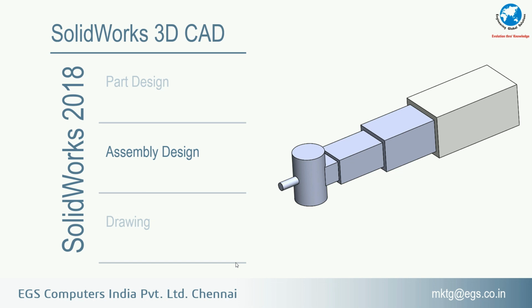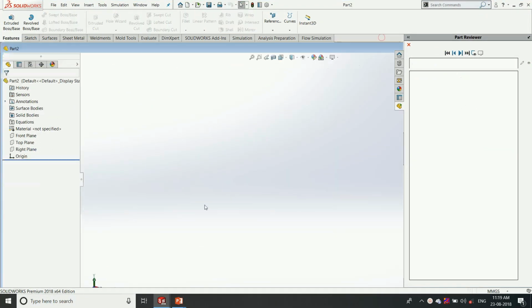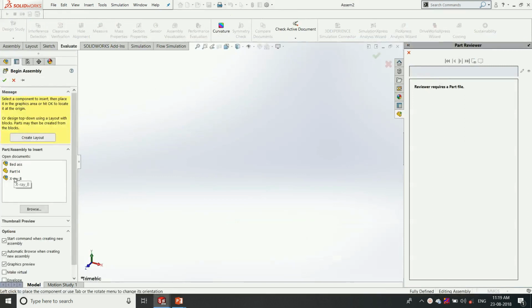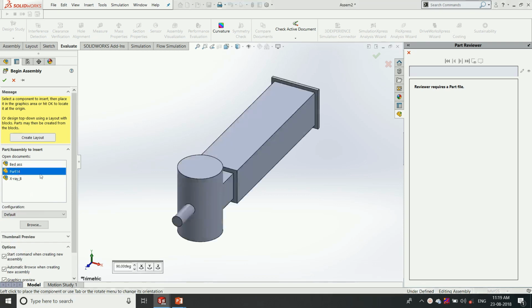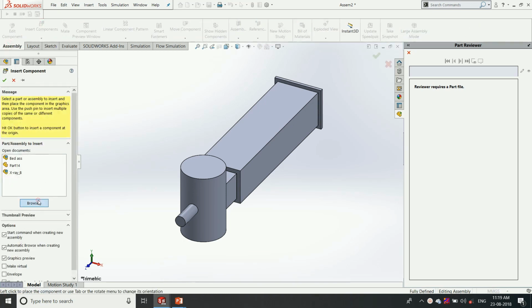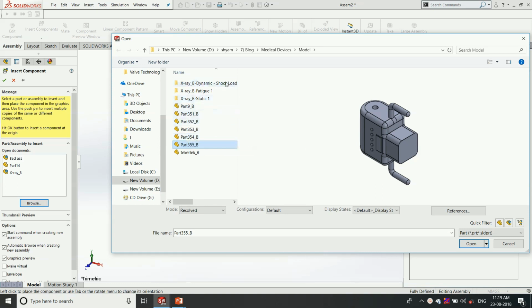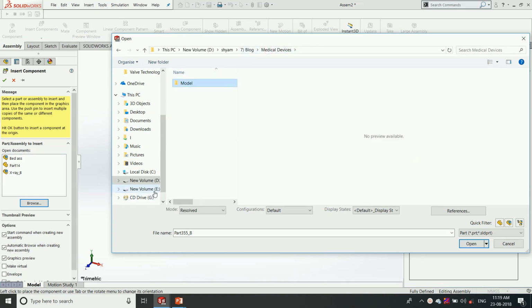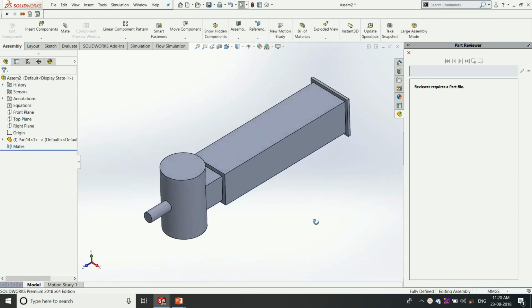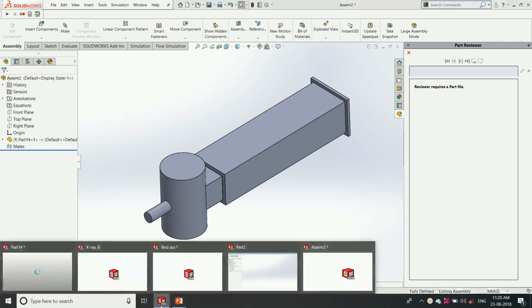In assembly design, once we design the part, we need to create an assembly of that component by simply choosing the new option, then going for assembly. Here we can just drag and drop the already drawn component like this. Then we can insert any other component we need. In this option we can choose from the list of components, and we have a preview option over here. So here we can choose whatever component we need. Then we can go for mate options. The mate options are available here with a list of options like coincident and mechanical mates.